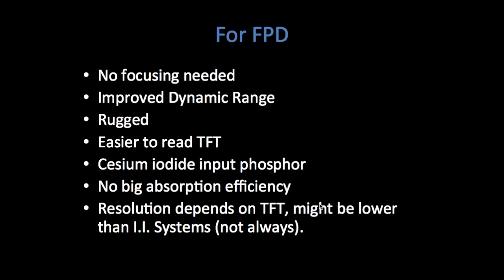Flat panel detectors offer additional advantages: no need for focusing, improved dynamic range, fewer moving parts making them more rugged and potentially longer-lasting, and easier electronics readout from the TFT. Downsides include: no improvement in absorption efficiency since the same cesium iodide phosphor is used to convert x-ray photons to light, and resolution depends on the TFT array — which may actually be lower than image intensifier systems in some cases.